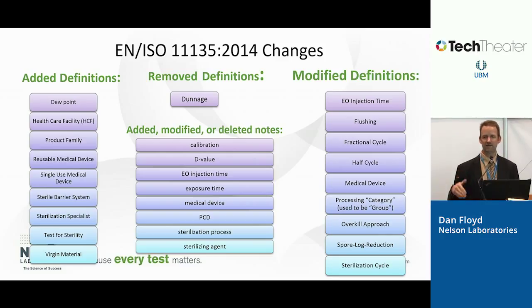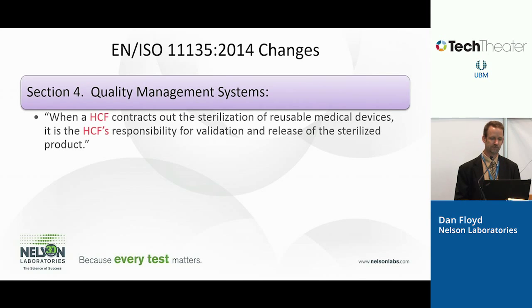They also added, not only that we mentioned they added healthcare, they've also added reusable devices to this standard, for devices that are going to be sterilized multiple times by maybe a healthcare facility. So a lot of these definitions, like reusable medical device, single-use medical device, some of those apply just to differentiate reusable versus single-use devices. So again, made some tweaks. Anytime they change standards, everybody's got to get their own definition in there. So they did change some of those.